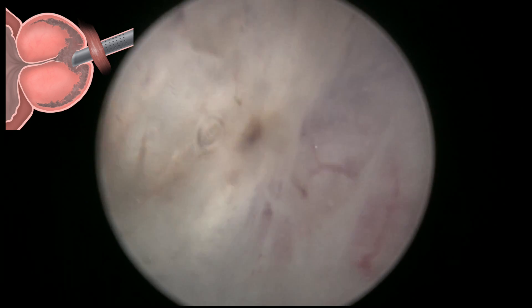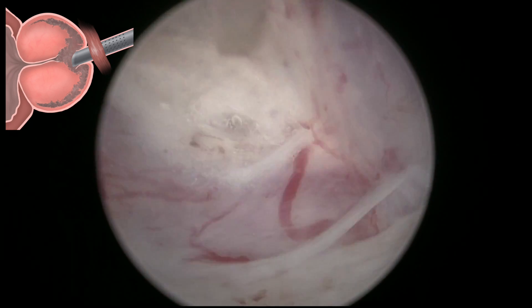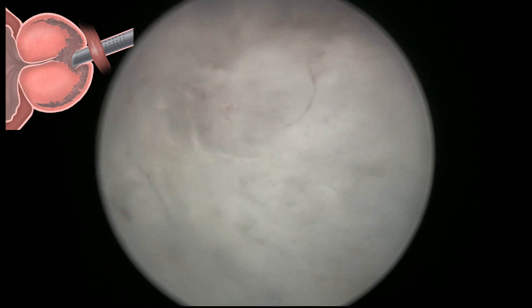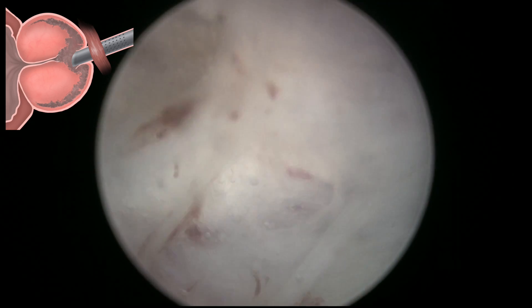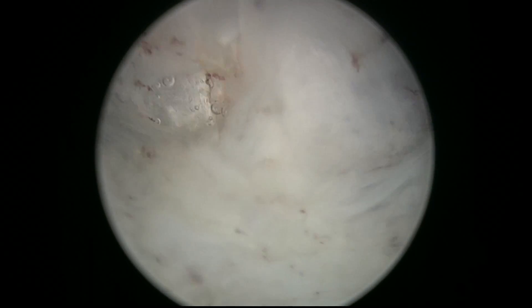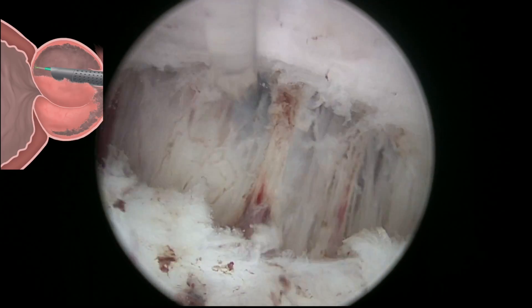After that we have a very nice surgical space that is irrigated perfectly by the scope. Visibility is great, and we have a circumferential line of dissection going around the adenoma, making it easy to follow this line while checking the quality of the tissues.